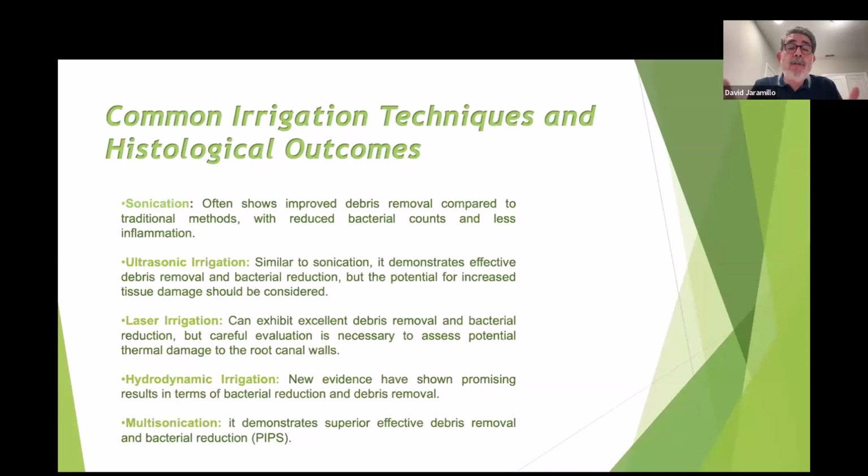It does a very good job in disinfection, but not as good a job as PIPS does. Why don't I mention SWEEPS? Because I haven't done any tests with SWEEPS. I only have done tests with PIPS, so I cannot talk on that aspect with SWEEPS. I can talk about different aspects of SWEEPS, but not the disinfection aspect.